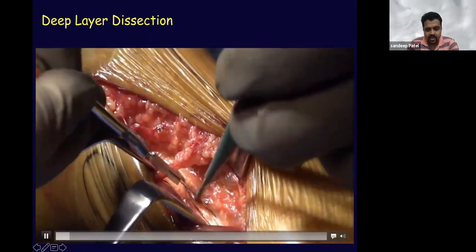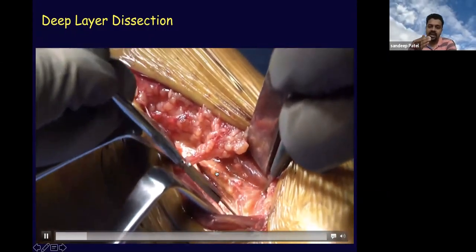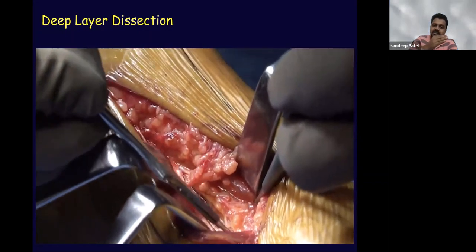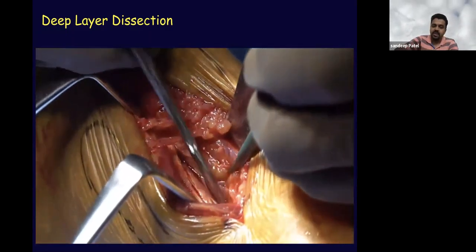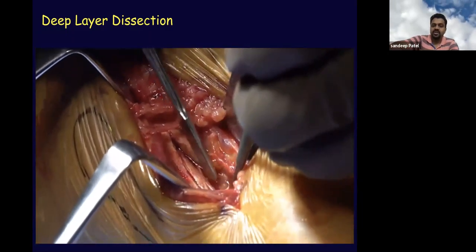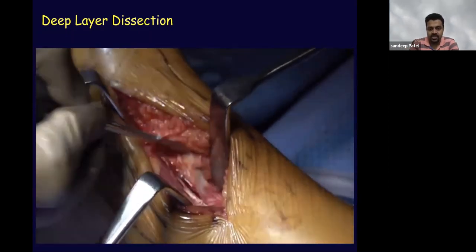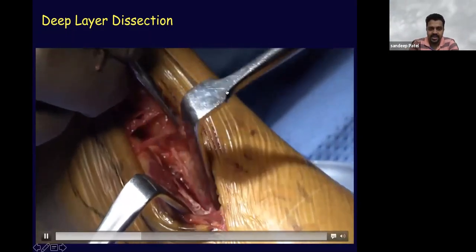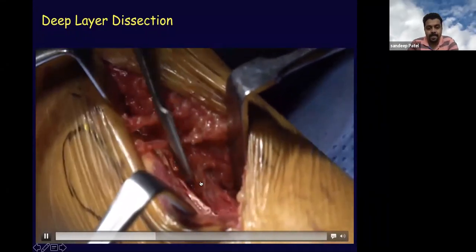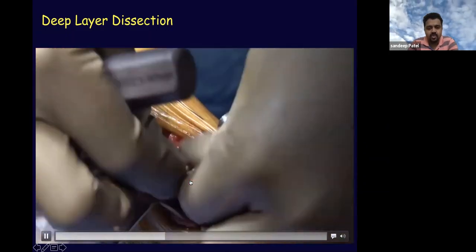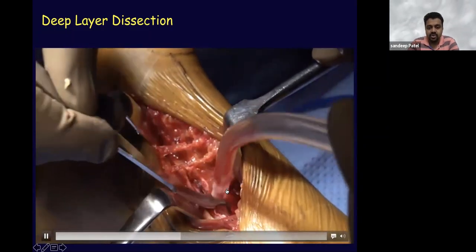In the deeper layer of dissection, this is the posterior border of the fibula, and we make a sharp dissection. The entire bulk is the flexor hallucis. The FHL has its origin from the posterior border of the fibula, the medial surface of the fibula, the interosseous membrane, and the posterior surface of the distal tibia. As a whole, the muscle needs to be elevated and taken medially. We then apply a retractor to create space and get more exposure.